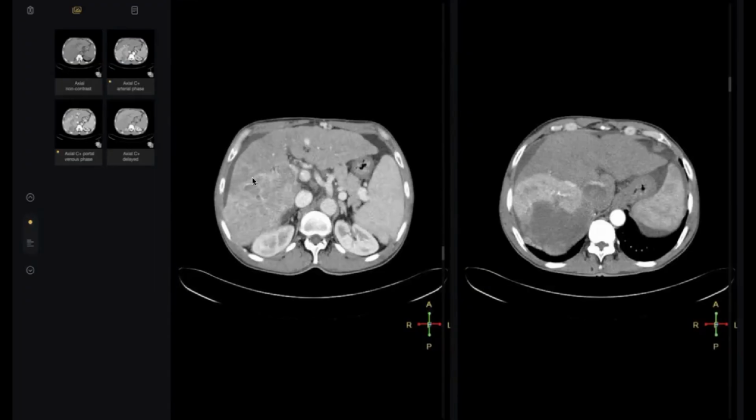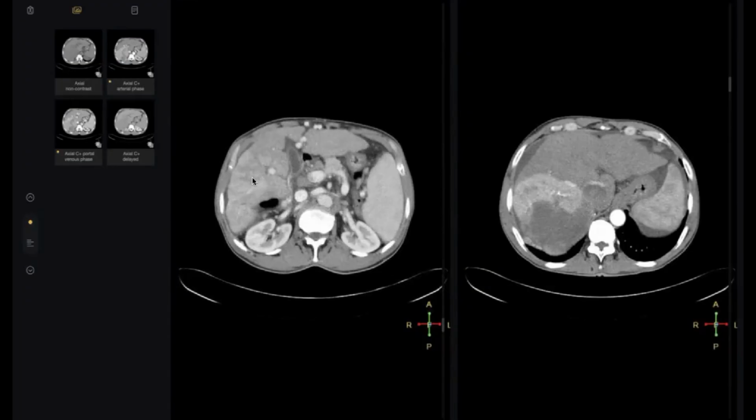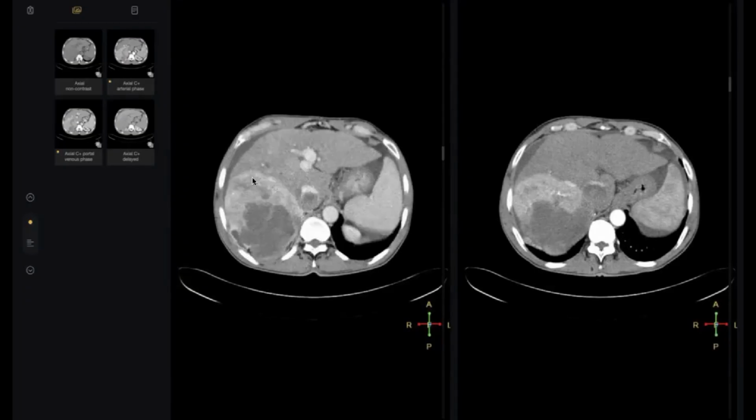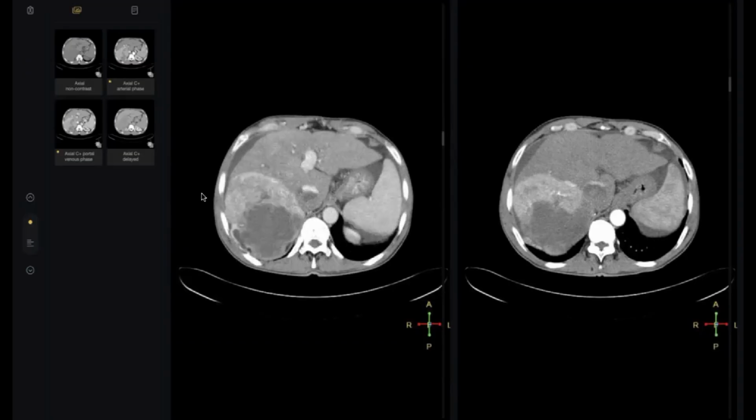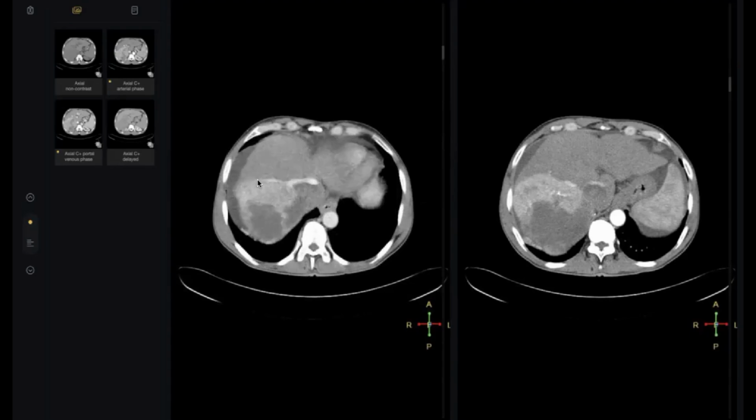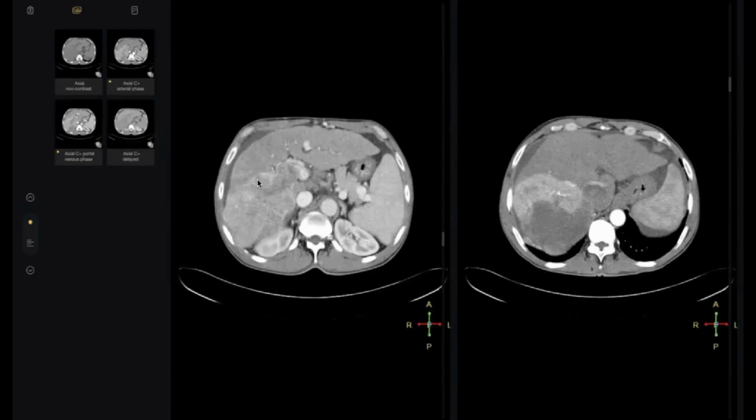So ascites should be removed first of all. Number two, take from the tumor proper. You do it sonar guided, open the Doppler box to avoid any vessel, and you should take a biopsy from the malignant tissue, but you should go through some of the normal liver parenchyma. Is it clear for you, doctor? Okay, thank you so much.